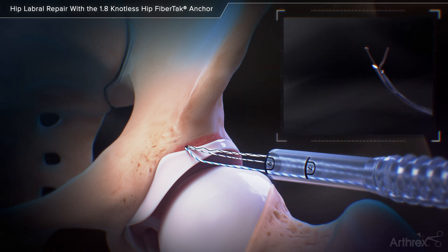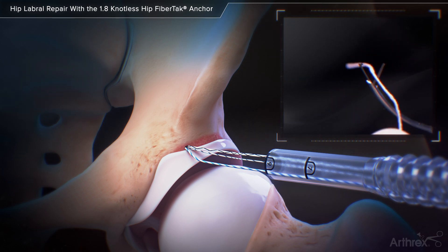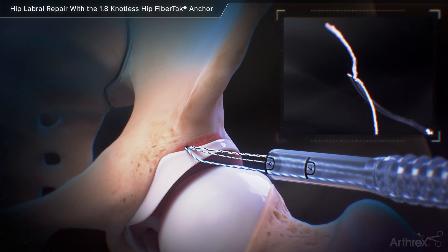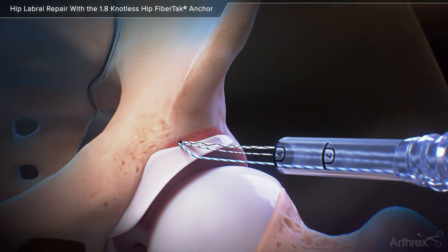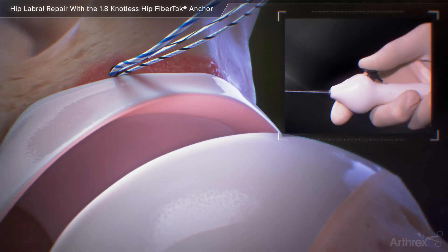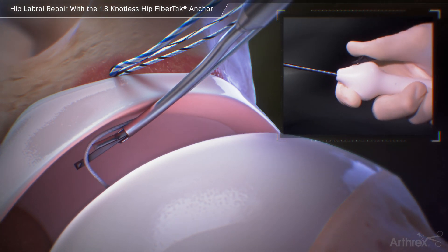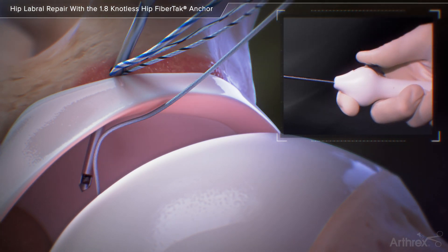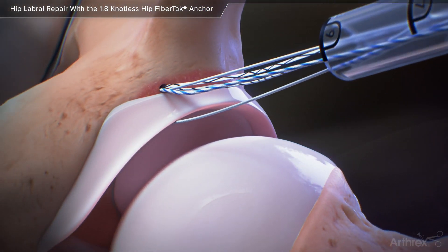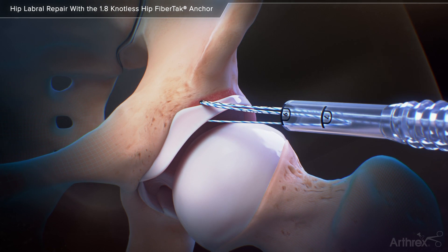Load a short tail of the white portion of the repair suture into the jaws of the swift stitch suture passer. Advance the swift stitch suture passer down the cannula and push it into the joint. Depress the black button and push it forward to release the suture into the joint. Pass the swift stitch through the base of the labrum and retrieve the suture, pulling out all slack from the suture.